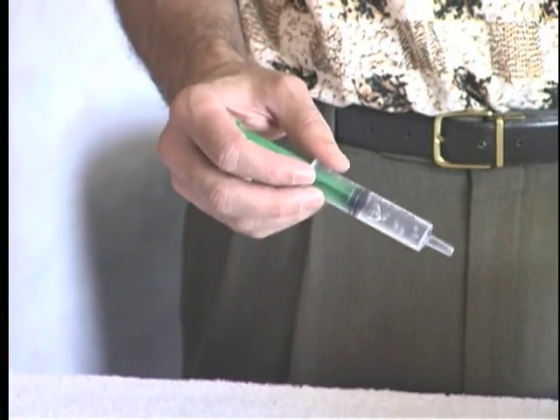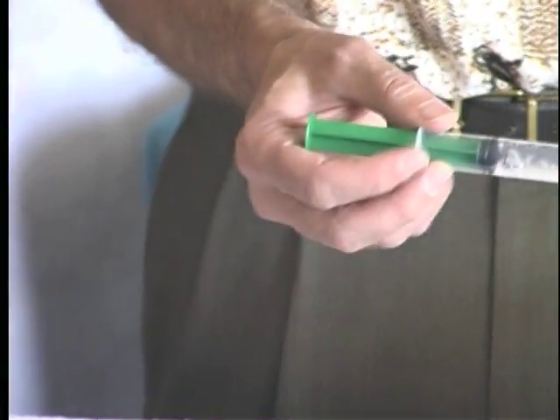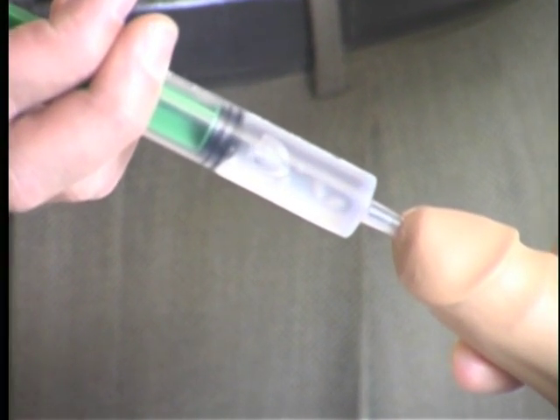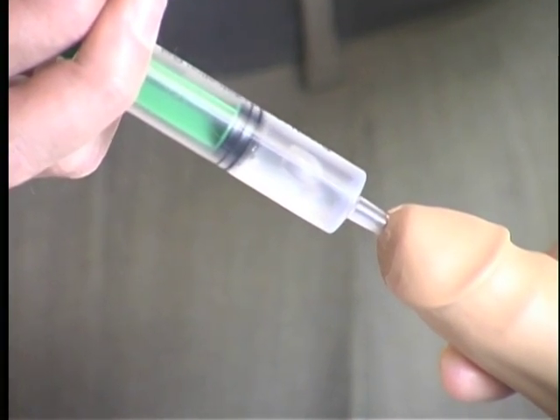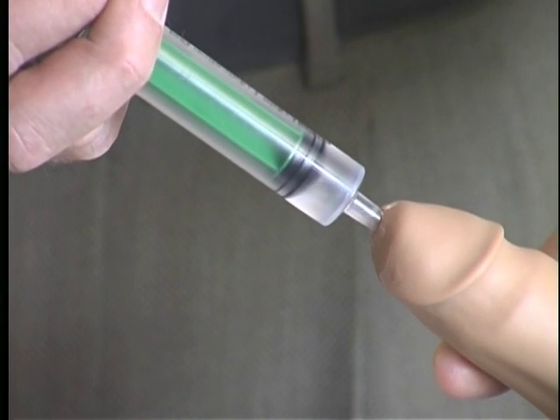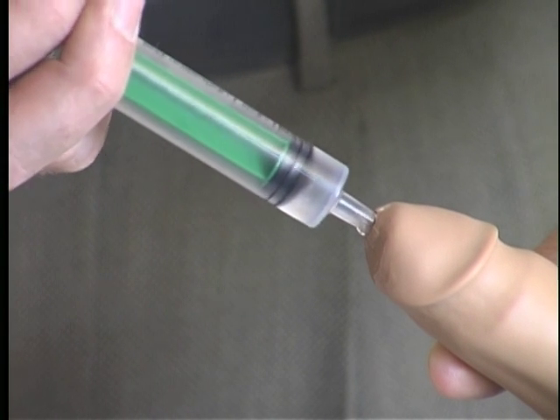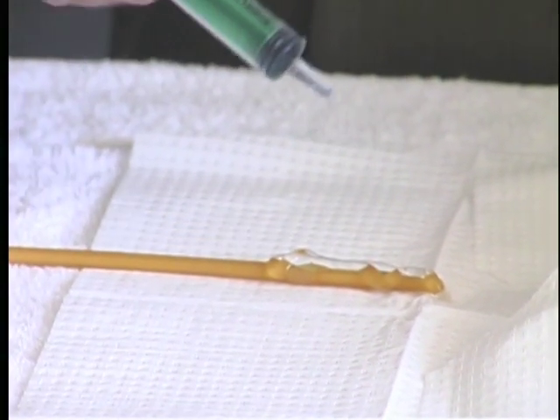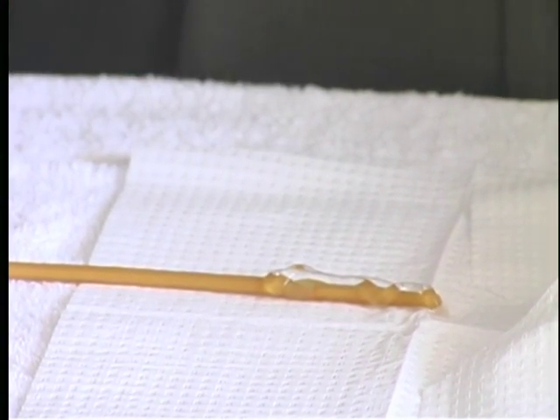This facilitates passage of a catheter if the syringe is brought gently to the meatus of the penis and the jelly is inserted slowly through the entire length. A small amount is left behind to allow for covering the first part of the catheter. This should be performed for any catheterization.